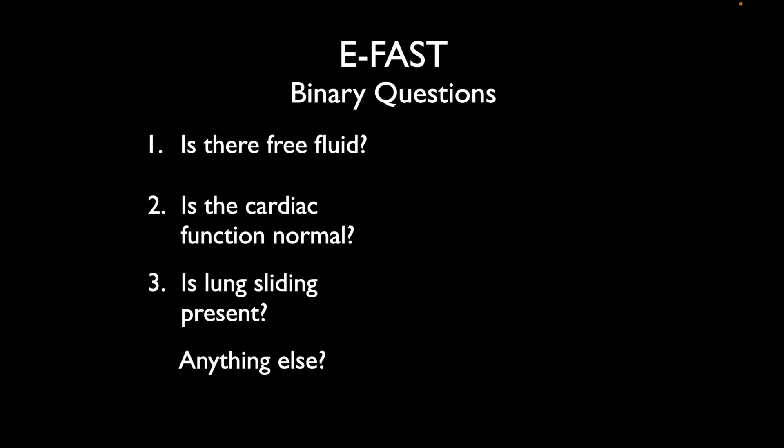So, as you went through those, were you able to identify the different findings? We're going to go through each one and answer these questions. I'll go through the images next and point out some key findings — good teaching points that I think will generally be helpful for people as they perform EFAST exams.